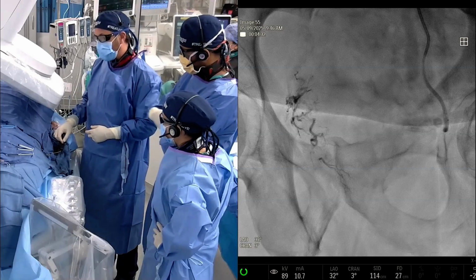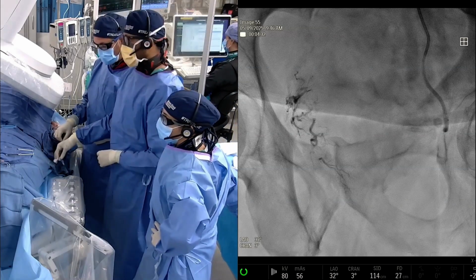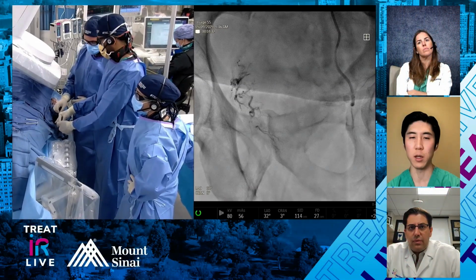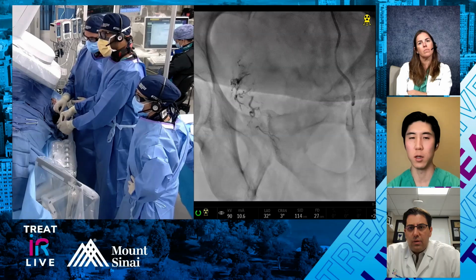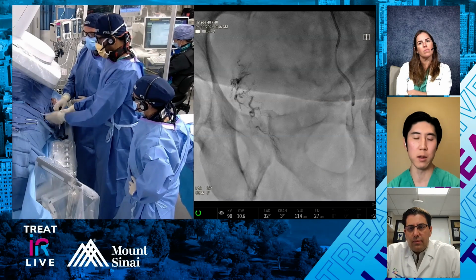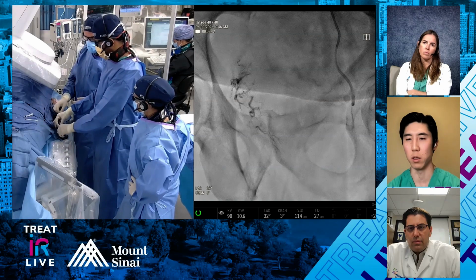All right, so we're going to inject some water here to start. Do you guys like our position, or would you move it? That's a good question. I think we know that the most symptomatic component is going to be that central portion. So I could see the argument if someone says, hey, you should go for the superior central median gland, but I think you're in a great spot and you got your sniper there. So I don't think you need to move it personally.